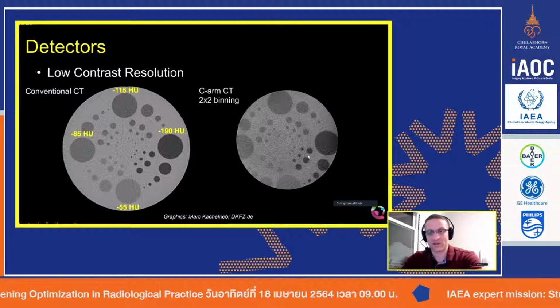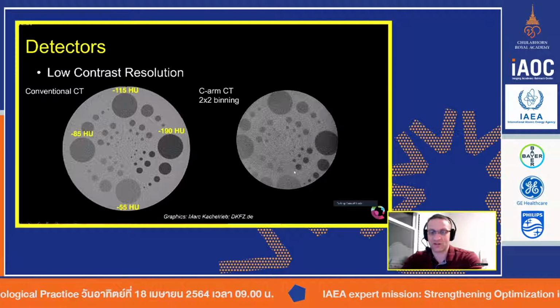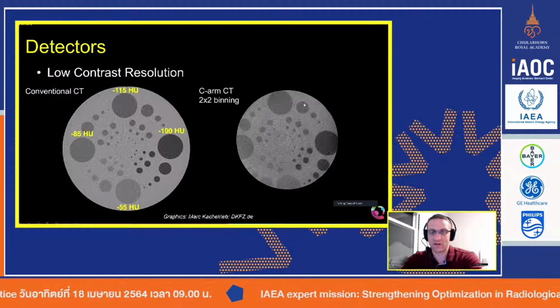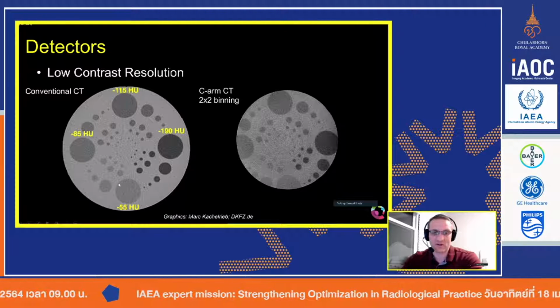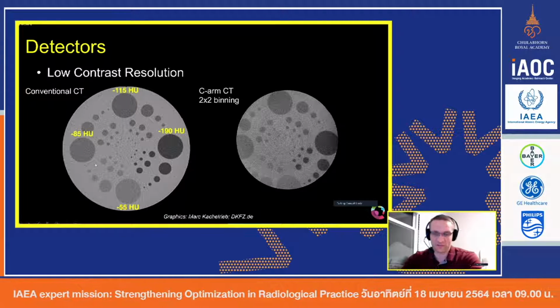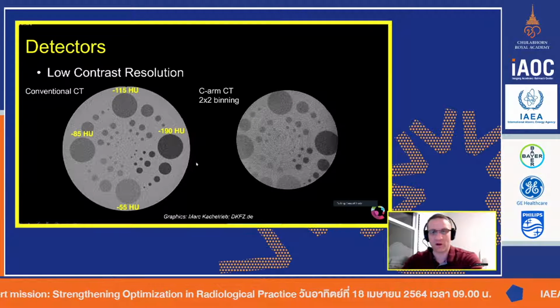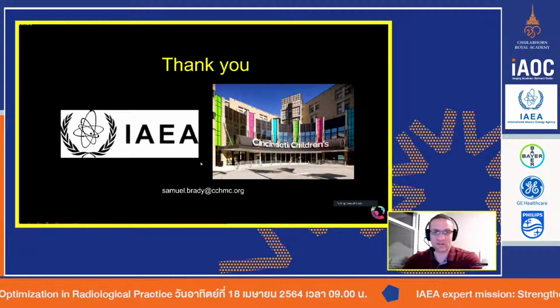But also, if you look at other aspects, the edges are crisper because the resolution is better. Whereas on the regular CT, the edges are not as strong because of the resolution effects, so these images look a little softer. And that goes back to that Mach band effect. And that was the last image on that one.